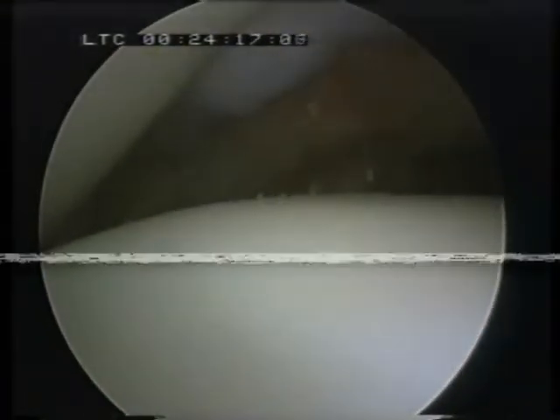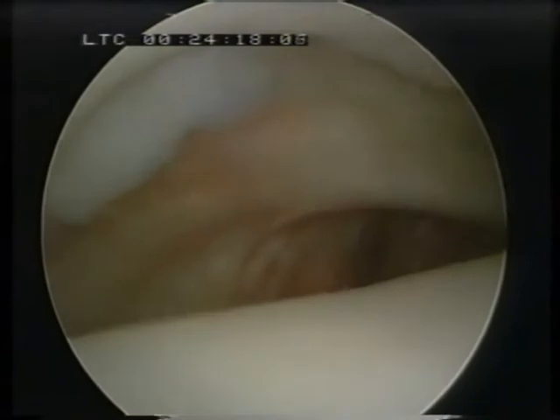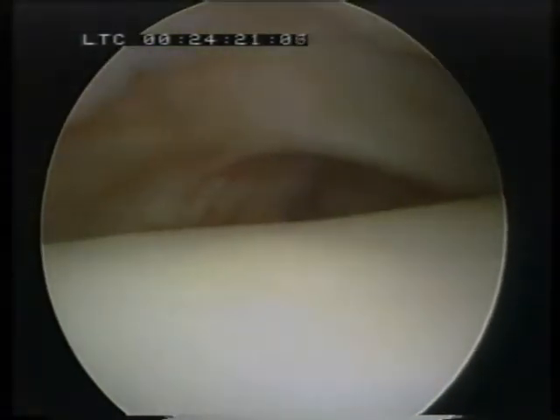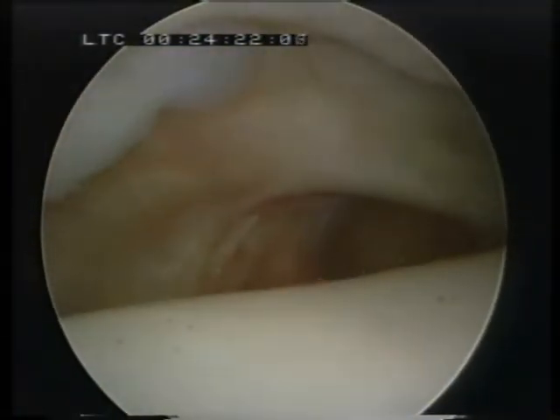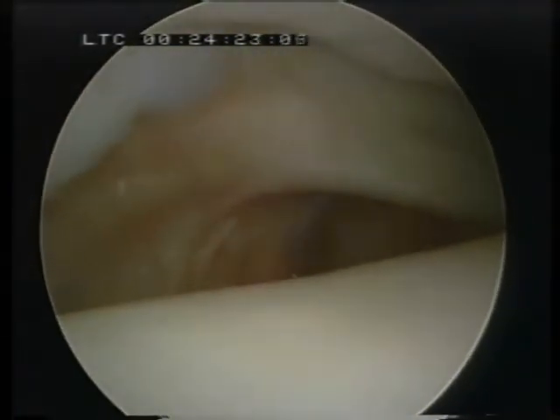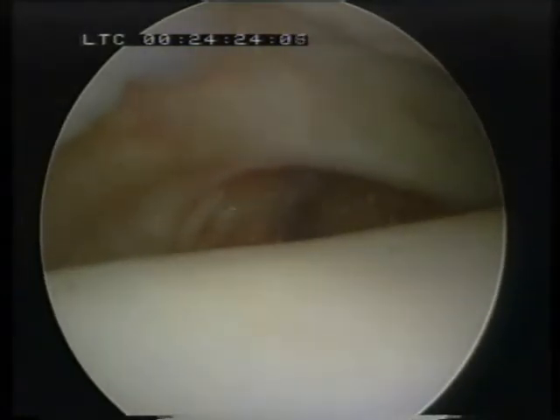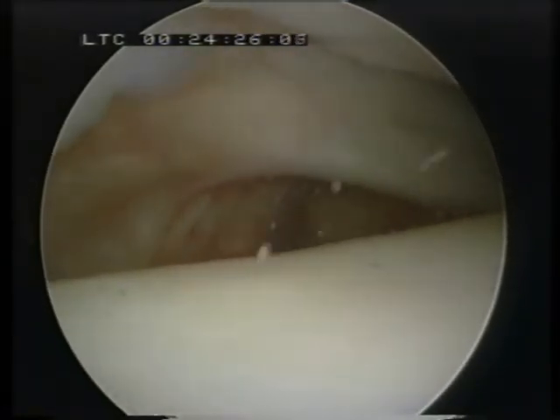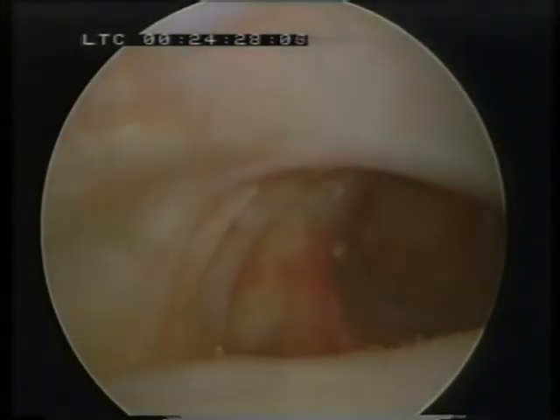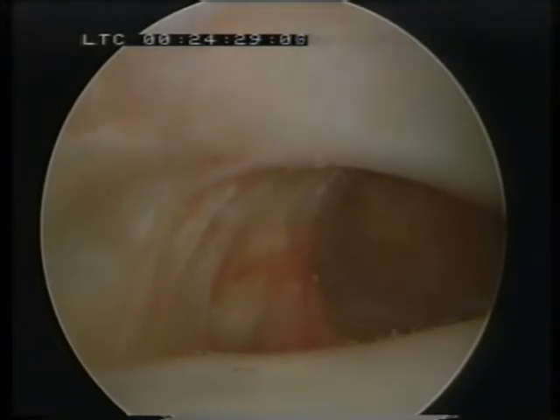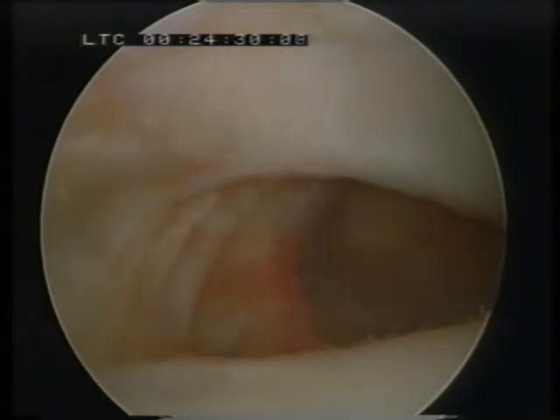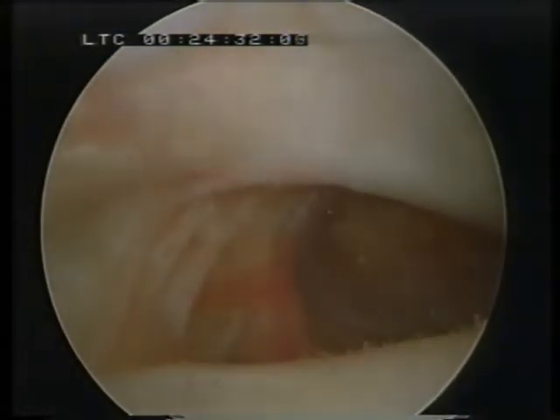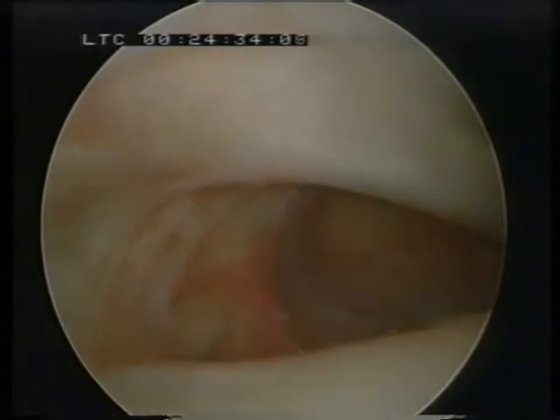You can see the posterior transverse tibiofibular ligament moving behind the synovium in this zone of the ankle.